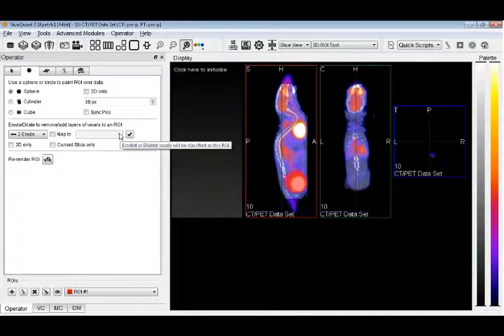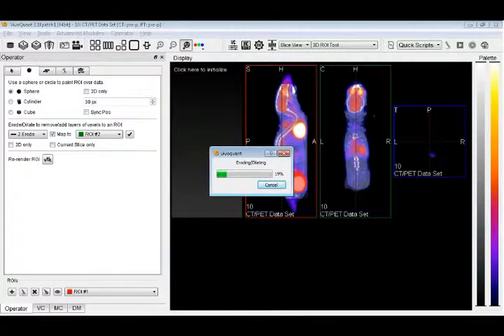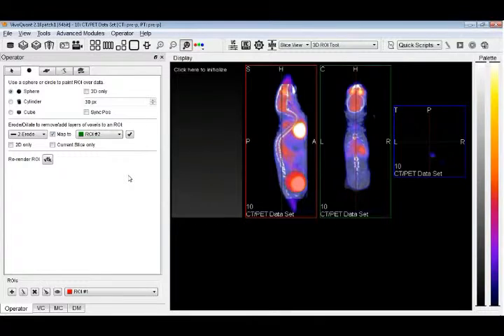And then we map the erosion to another ROI. And so you can see that created. Can everyone see that? I'll make the next one a little bit thicker so you can see it.